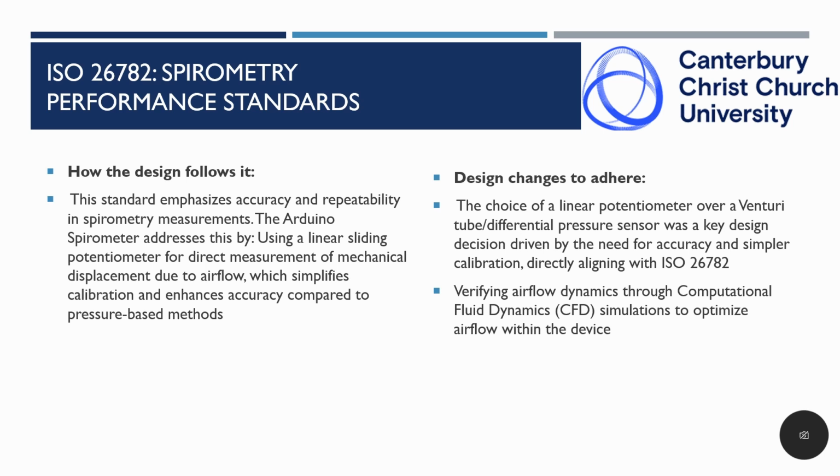Instead of using more complex technologies like Venturi tubes or differential pressure sensors, the choice of a linear potentiometer was made to ensure better accuracy and easier calibration, aligning with ISO 26782.